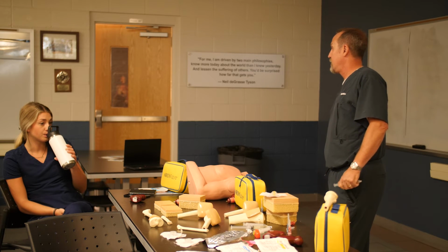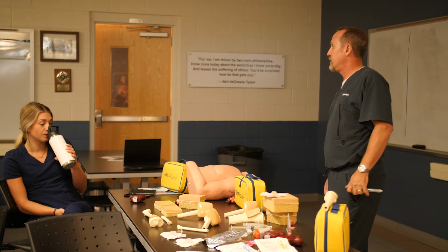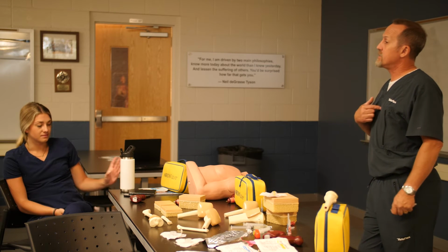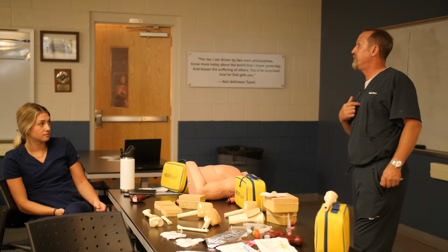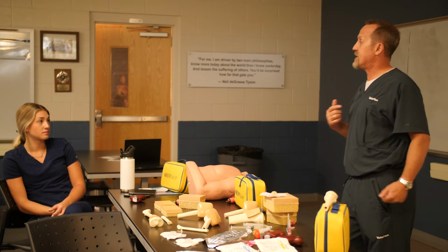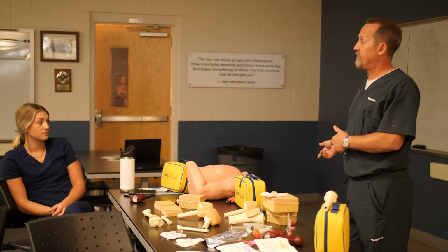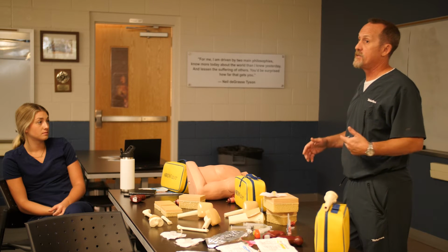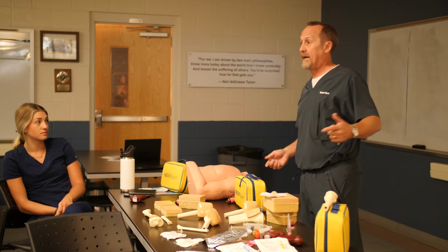I was just reading the pamphlet and it said no to the sternum, and we get that question. Yeah. And I didn't know if there was any evidence behind it. It seems to me like if you go too deep, there's a lot of great vessels. There's a sternum there. There's a lot of stuff underneath there, and if you go too deep, it can be significantly dangerous. And as I mentioned, the military uses it as, this person's gonna die if we don't get fluids in and stop the bleeding, but they're not gonna do anything else. They're not gonna sit there and do compressions and try to revive the patient when they're getting shot at. So they're just doing what's easiest and getting them out of there.